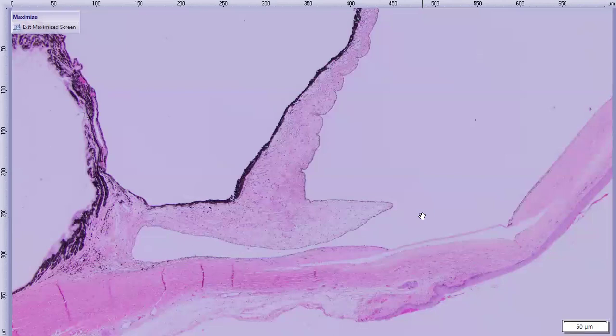So, I think sometimes we see really robust fibrosis like this with young animals. So I wonder if this goat, like trauma, I agree with, it's very suggestive of trauma, but the degree of fibrosis I think of as a young animal thing. And so maybe he's had this problem for a long time. Maybe. Who knows? It's interesting. I don't know what their durations are.